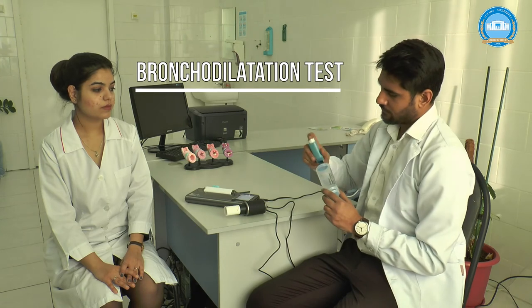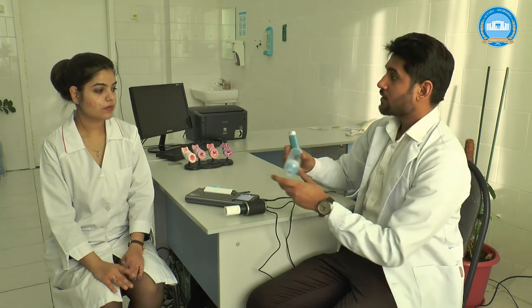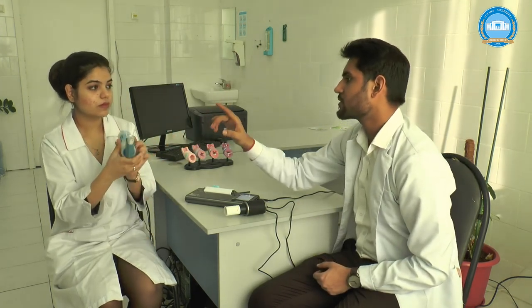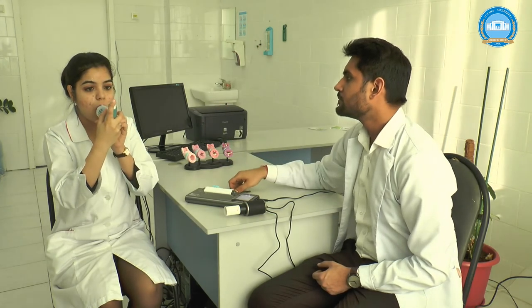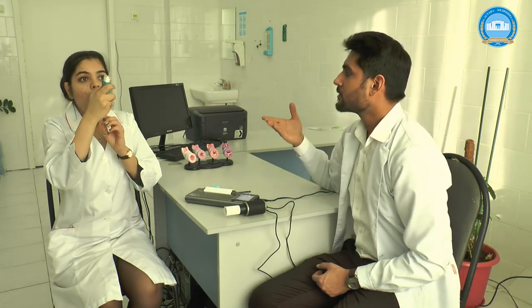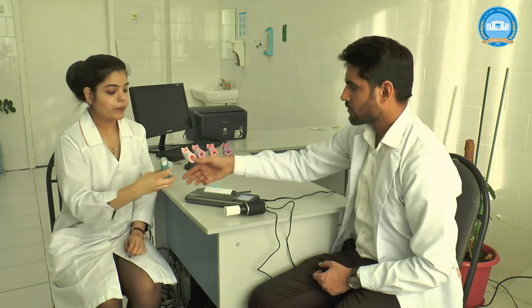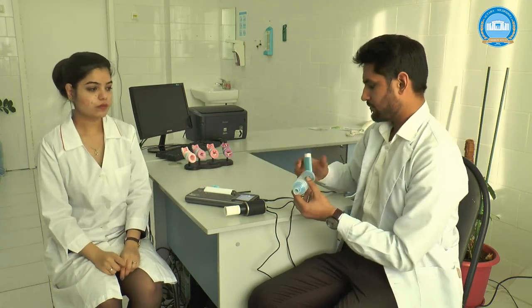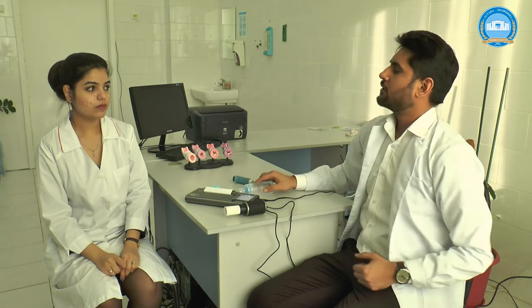Bronchodilation tests are used to determine the reversibility of bronchial obstruction. A bronchodilation test is performed — spirometry is repeated after inhalation of a bronchodilator, for example, a short-acting inhaled beta-2 agonist or anticholinergic drugs.